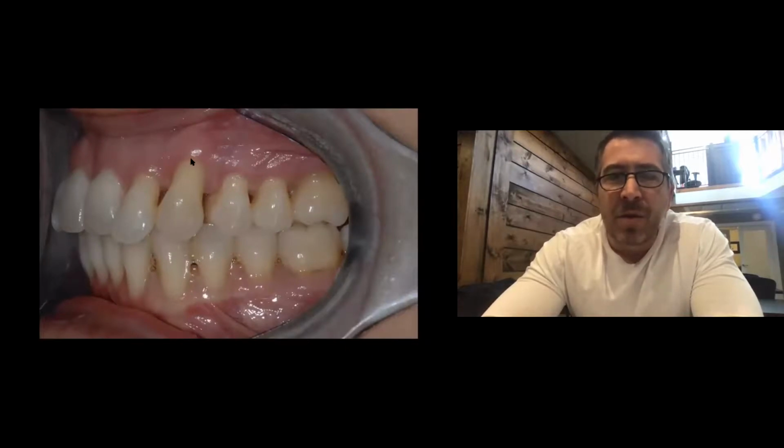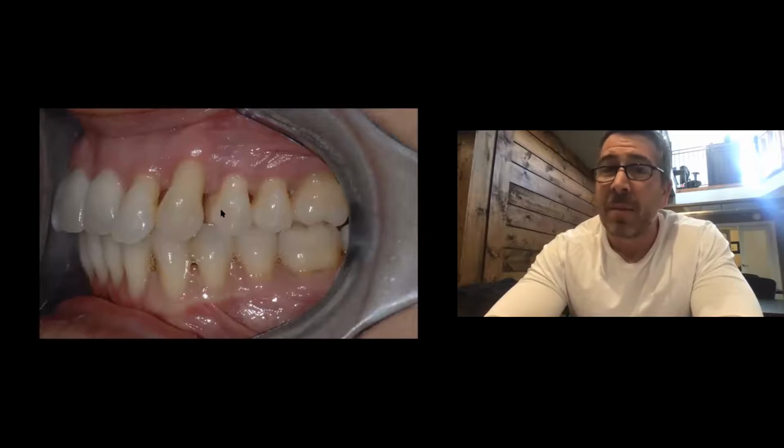This side is worse. Look at the embrasures. We got a zenith problem on this cuspid. We got a zenith problem on this lateral. So the left side, the 2-2 and 2-3, is going to be more difficult when she loses those teeth to get those zeniths in the right position without doing some kind of reconstruction and some kind of augmentation. When you look at her radiographs, look at the cuspid. You can see that the interdental heights of bone are not in good positions.